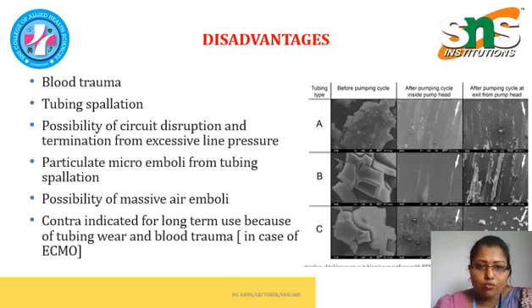Disadvantages: blood trauma, tubing spallation, possibility of circuit disruption and termination from excessive line pressure, particulate microemboli from tubing spallation, possibility of massive air emboli, contraindicated for long-term use because of tubing wear and blood trauma.